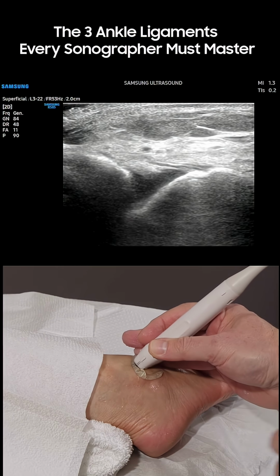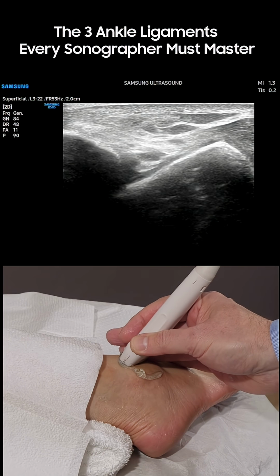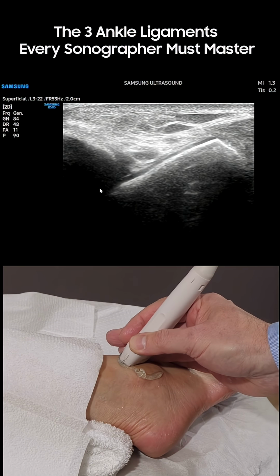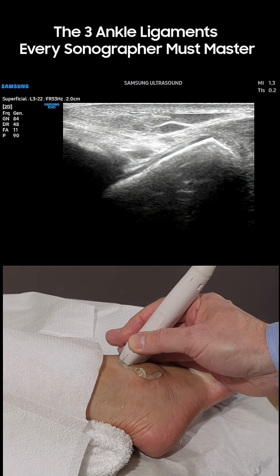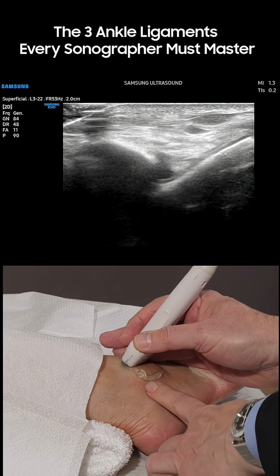Now, one pitfall is if you're too proximal, let's say you're up here, it could look like the ligament is gone, like a chronic tear. The key to know that we're in the wrong location is we can see the hyaline cartilage of the talus. We're too high. So the idea here is always err on going distal.